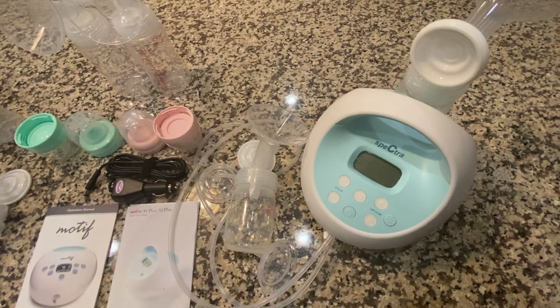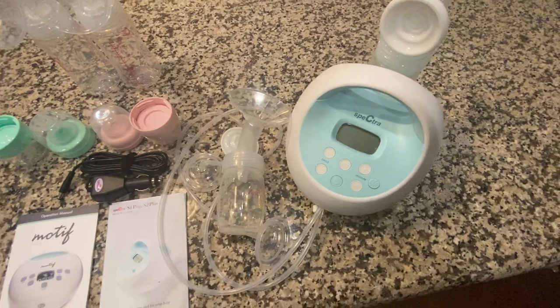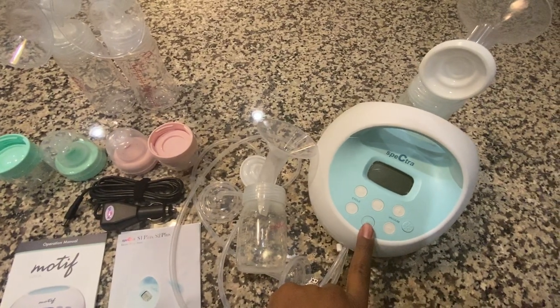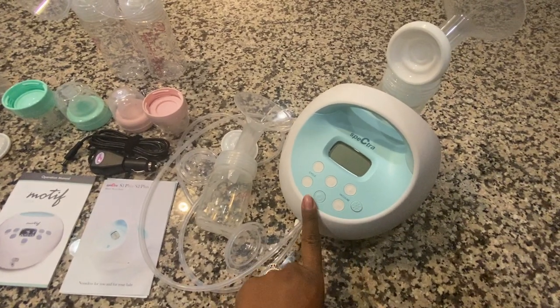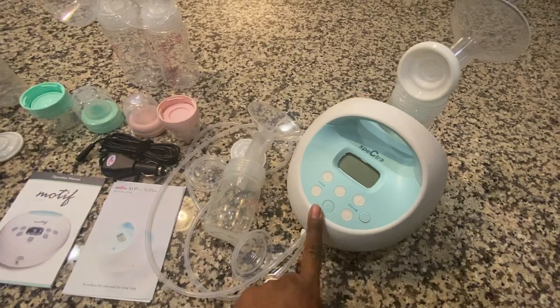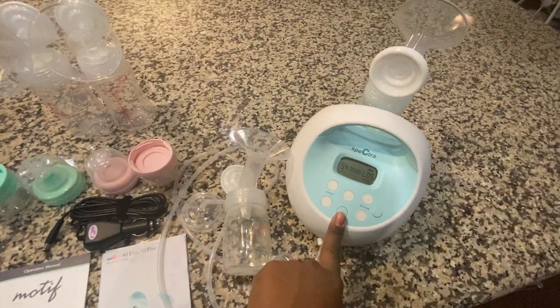Now let's talk about the Spectra S1. I've been using this pump since January, so I'm more familiar with it. Spectra is a really good brand and I love it — one of my best friends recommended it. With my insurance I paid $50 as an upgrade option. Again, this is the S1, the portable version. They also have an S2, which is not portable — that's the only difference between the two Spectra models.